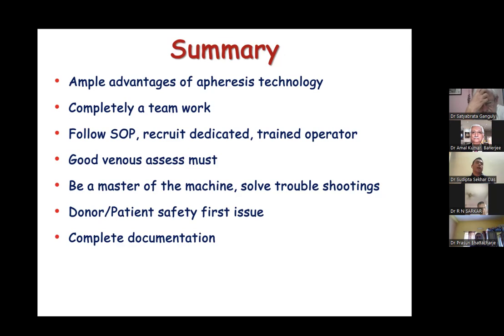But before that, we have done 3 procedures of platelet reduction from 25 lakhs. The first procedure came to 13 lakhs, from 13 lakhs to 9 lakhs, from 9 lakhs to 4 lakhs. So it came to 4 lakhs, then only the patient was taken for a cardiac surgery. So this is the beauty of apheresis procedure, right?